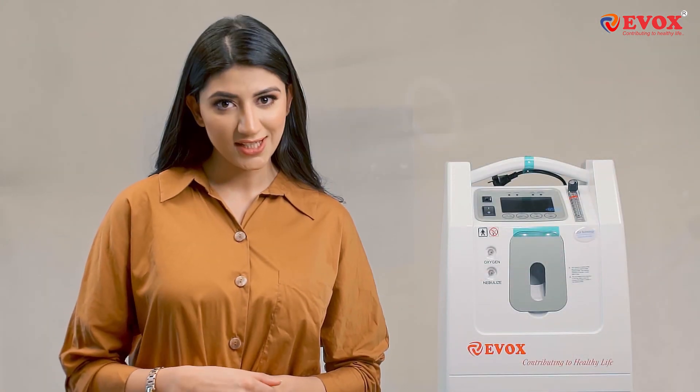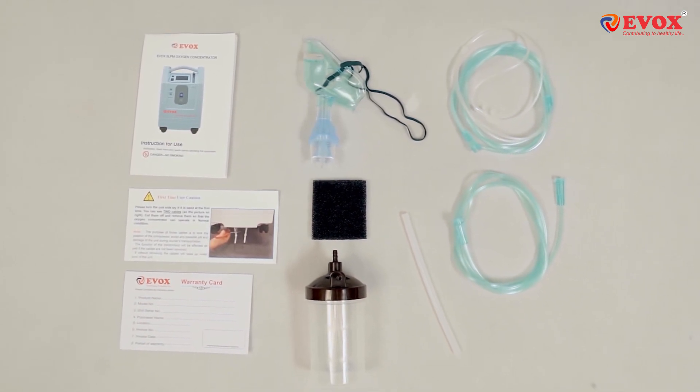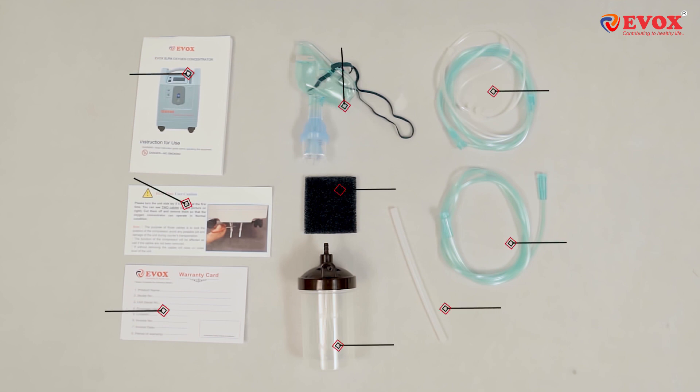Let's have a look at the accessories and then we'll move on to the easy installation guides. These are the accessories and components that come along with the Evox Oxygen Concentrator.